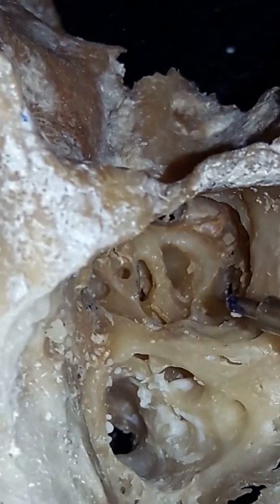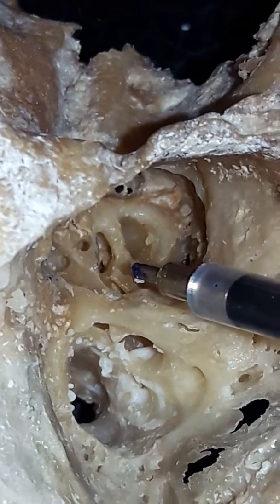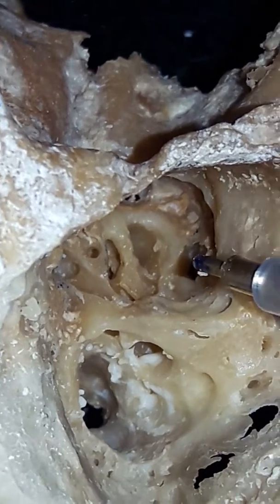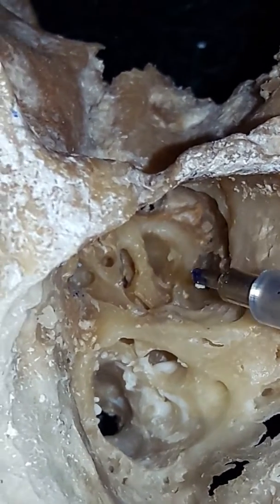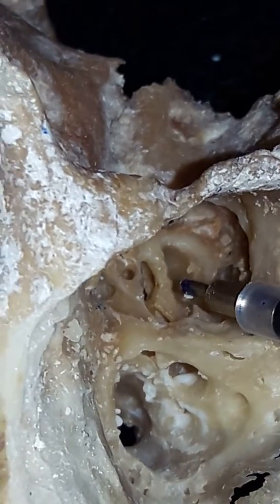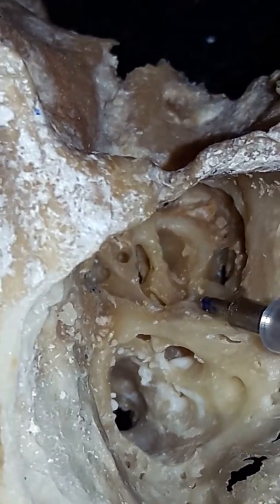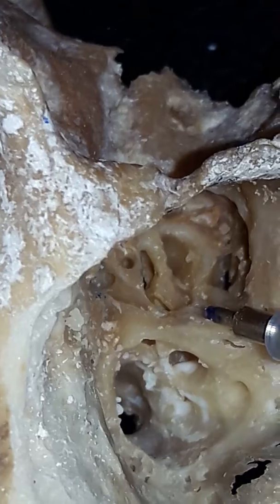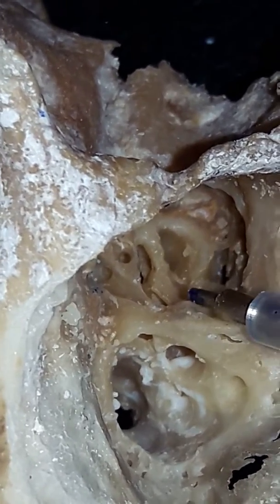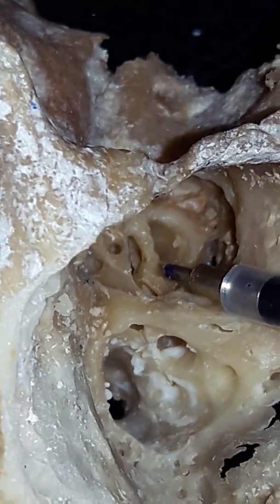Okay. Then the leftover point is, when we are confused with the identification of the round window, one point I told you: drill the hypotympanic cells, identify the ivory bone of the outer wall of the cochlea, and then make a cochleostomy into the scala tympani. Another important point is the fustis. This fustis is like a hill coming from the retrotympanum towards the round window. Here this is the fustis. This fustis directs towards the round window.